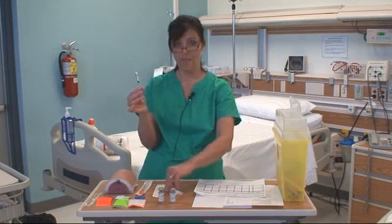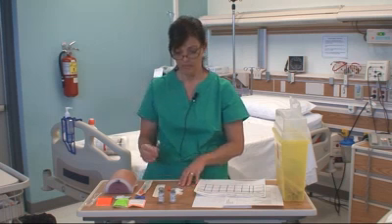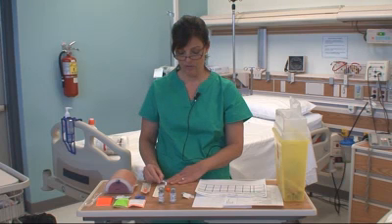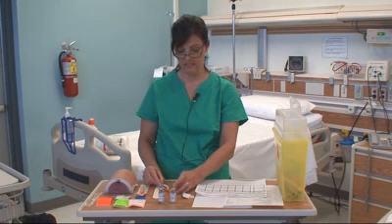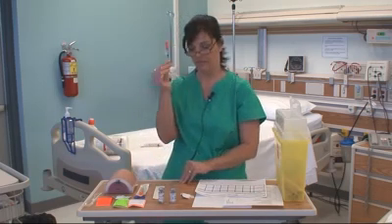Typically we don't recap, but because I want to go into my patient to administer, I take my syringe and needle and slide it to put my cap on like this for safety reasons.